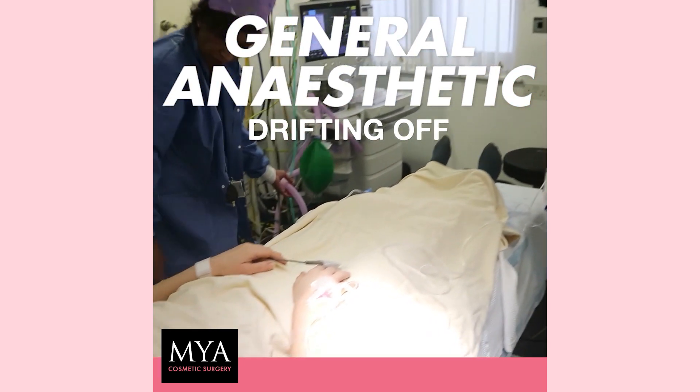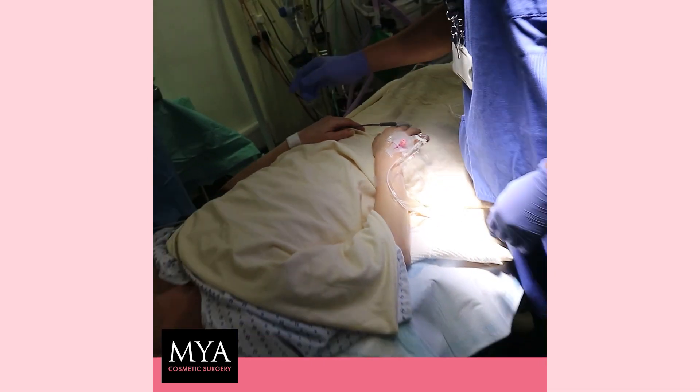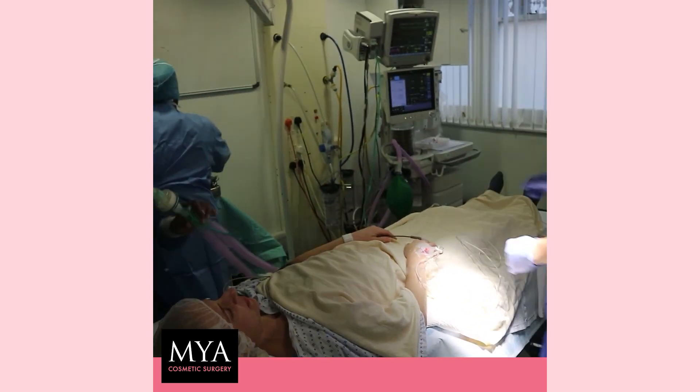It's starting to feel a bit. Brilliant. So at that point we're just going to give you some oxygen to breathe. There we go. Just oxygen level.